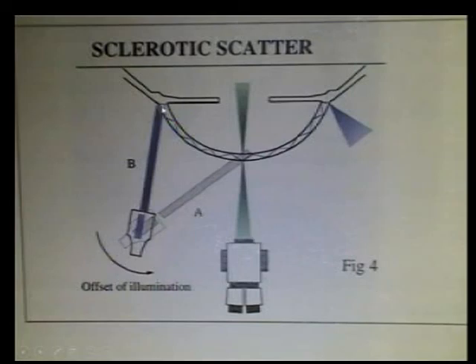What happens is when you hit it right on the temporal limbus, the light bounces back and forth, just like fiber optics, between the epithelium and the endothelium, all the way across to the other side, actually all the way around in all directions. If something blocks the path of the light, some small opacity, it will reflect the light back into your eye, making it visible. So for picking up big opacities, significant edema, and things like that, sclerotic scatter can be very helpful.